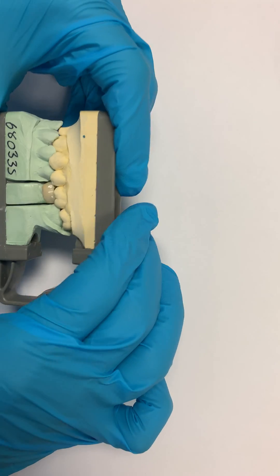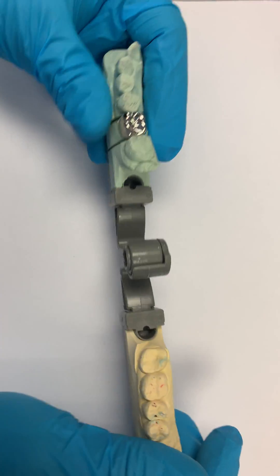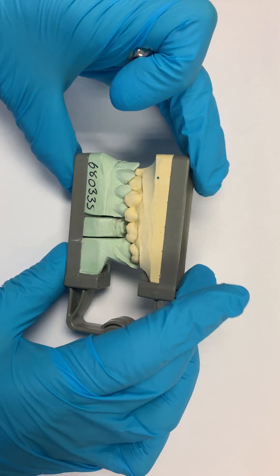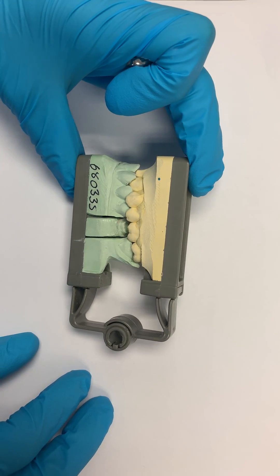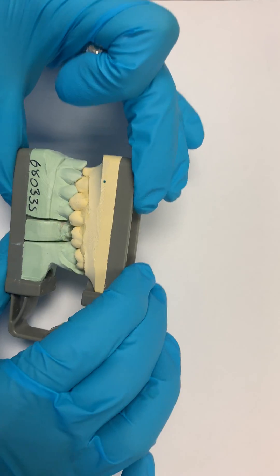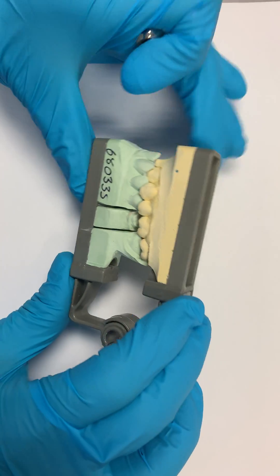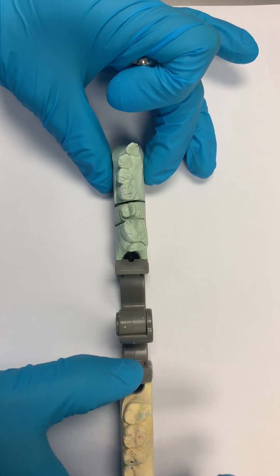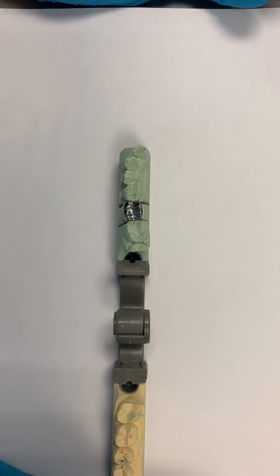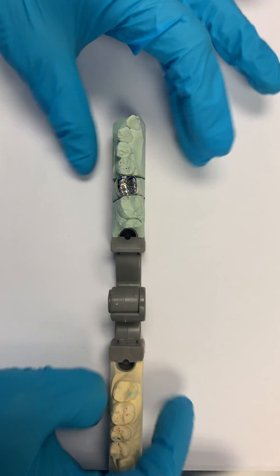Another disadvantage is that eight out of ten times the occlusion will come a little bit high, and that for me is one of the biggest problems because we really don't know how the occlusion will be. The one advantage is just one impression gives you upper and lower, but there is a real potential distortion problem, and in terms of clinical time, you'll likely spend extra time adjusting the crown in the patient's mouth. So it all depends case by case.